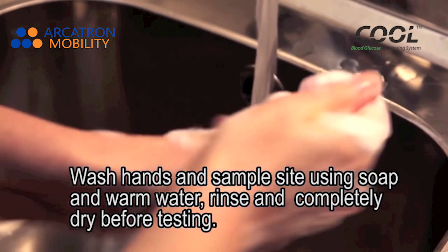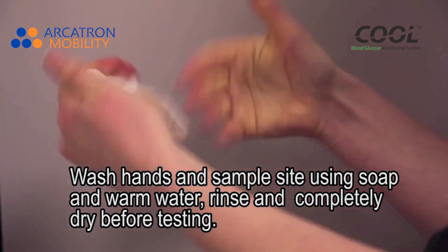Wash hands and sample site using soap and warm water. Rinse and completely dry before testing.